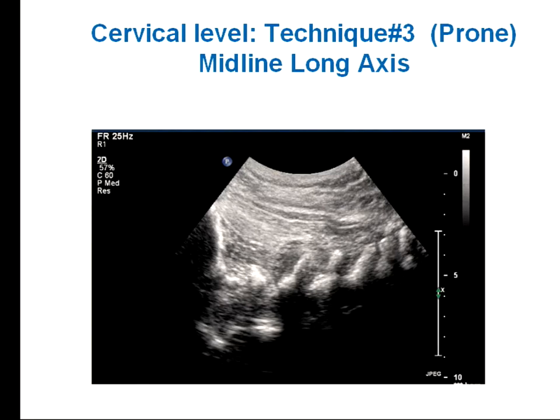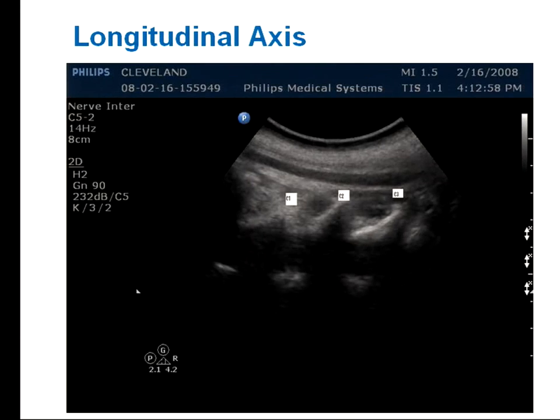When the patient is prone, even in big patients, you still can see the bony surfaces. This is a few centimeters of fat here. This is the occiput, no spinous process, C1. This is the largest window, between C1 and C2, so you can see through. Spinous process of C2, C3, and C4. The same: occiput, C1, C2.